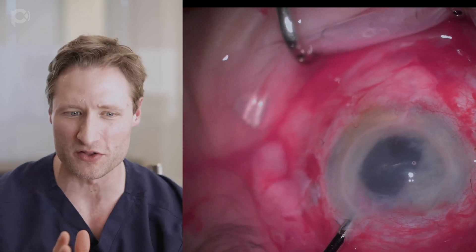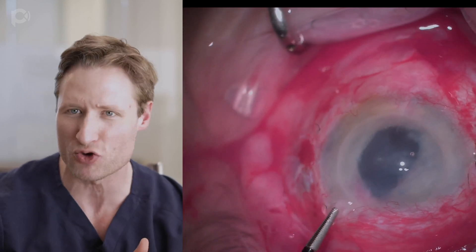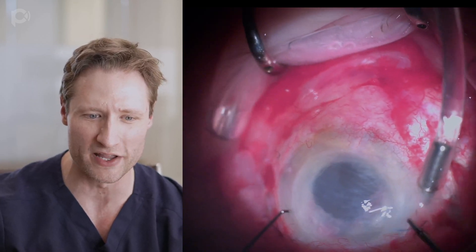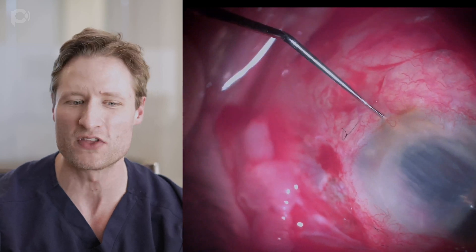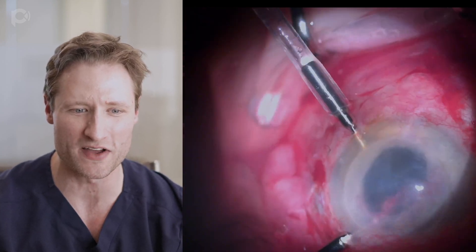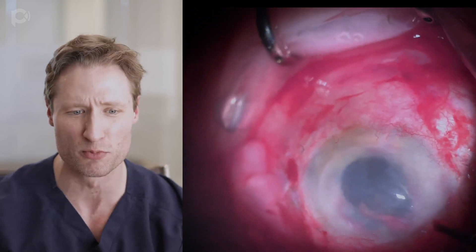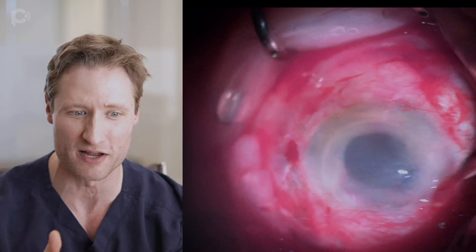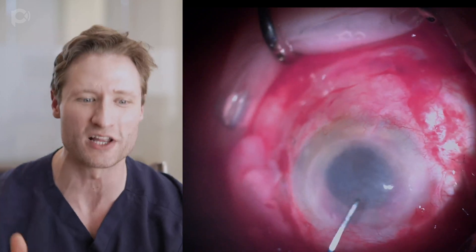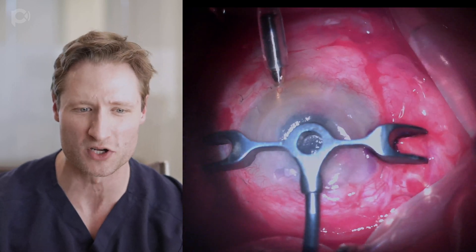This takes me forever. This is a highly edited video because I spend an hour stripping all of this out of the eye. At some point I engage part of the lens, the haptic breaks off, then I have to remove the optic from the eye. Finally we have something we can work with once all this fibrous tissue is removed. A vitrectomy is done by me — that's not shown here — but there is an enormous amount of fooling and fiddling to clean up this part of the eye and figure out what's going on.